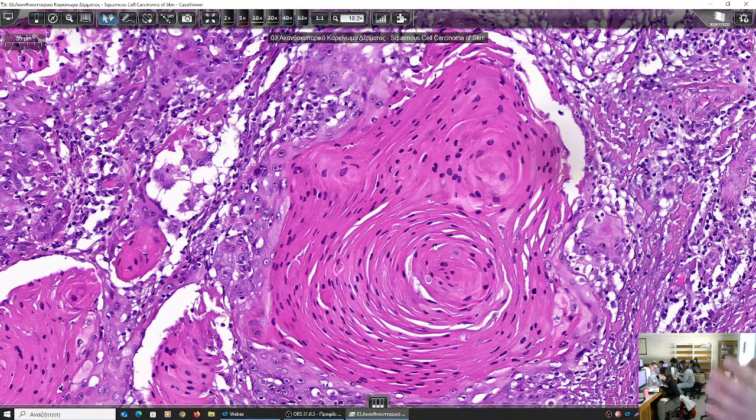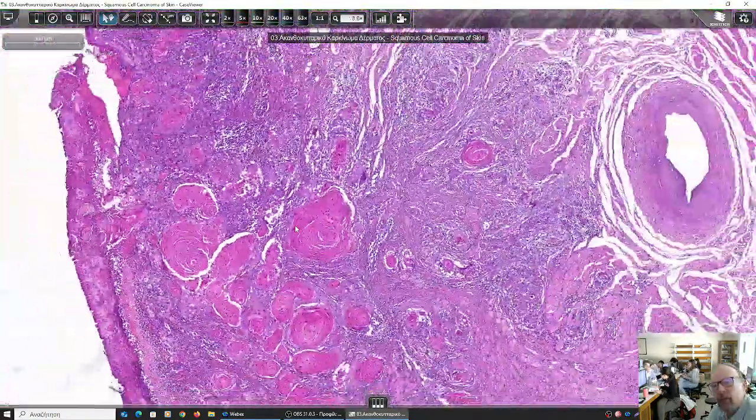And since the malignant cells are widely keratinized, it is of low grade. Of low grade. That means it looks like normal, however, it is malignant. This is grade 1, low grade or high differentiation. That means it has signs of maturity despite being invasive and malignant. So this is a well-differentiated squamous cell carcinoma.